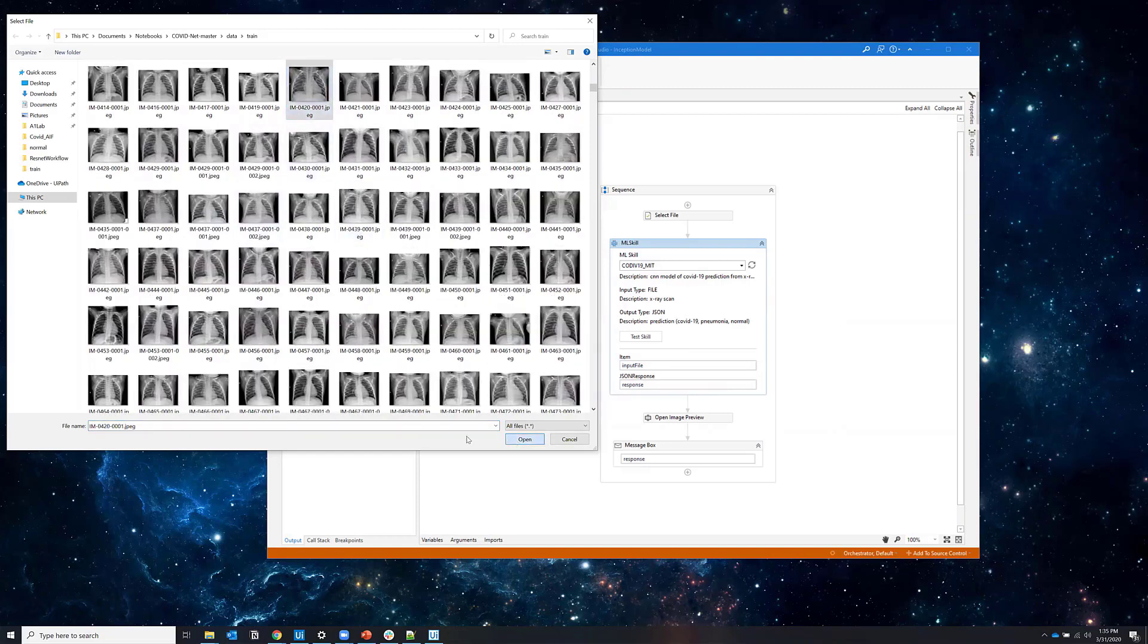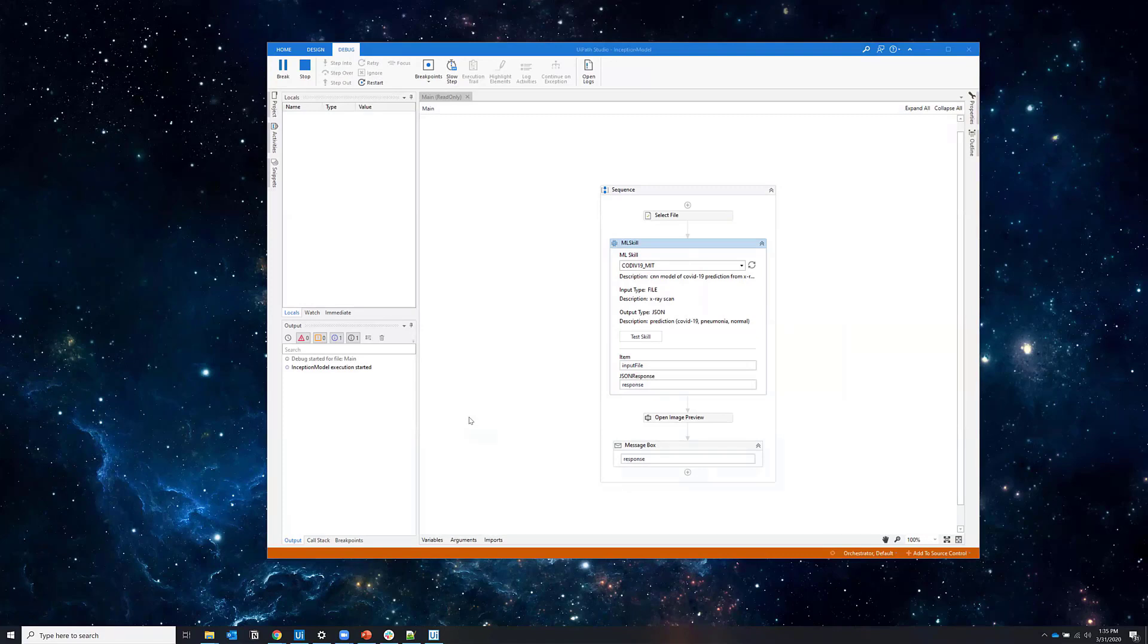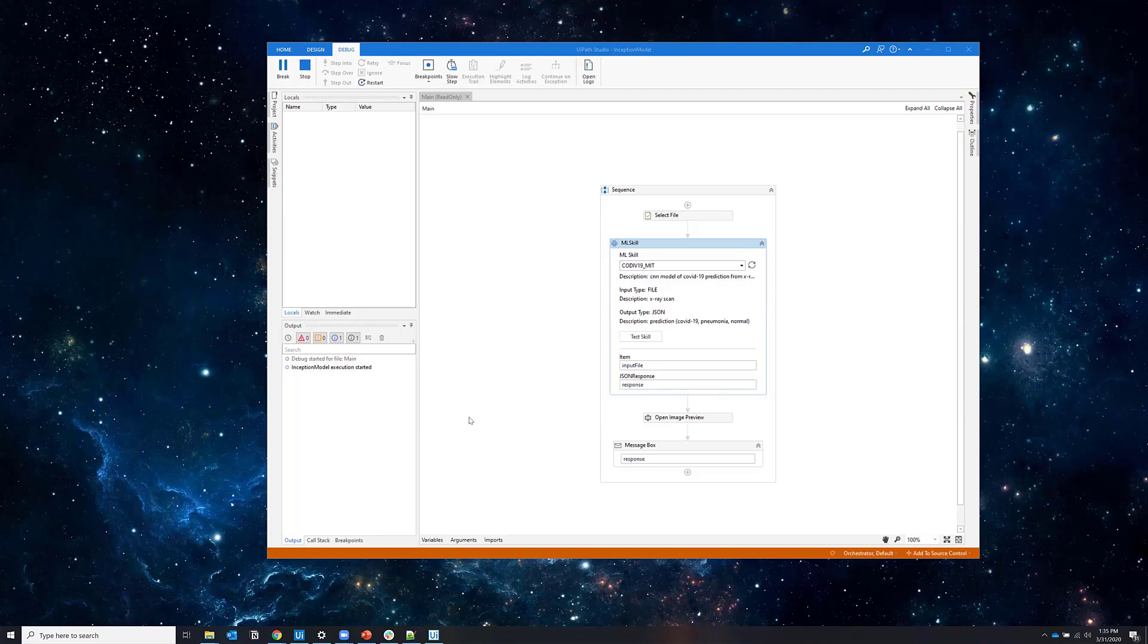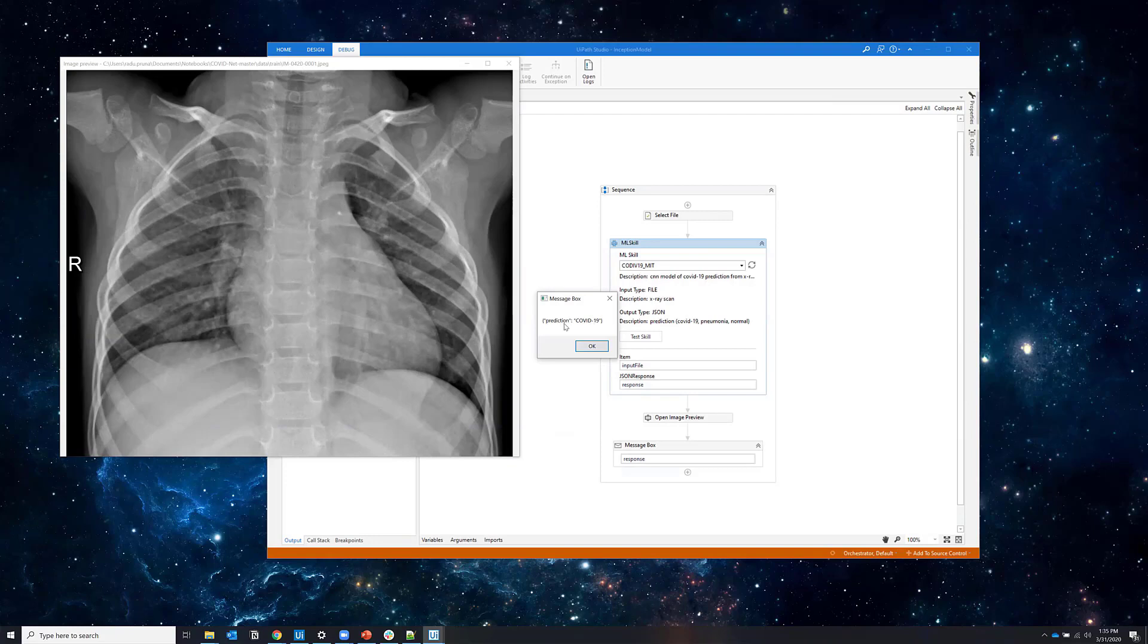So opening a random image, this is sent to the model. And what you'll see next is the machine learning classification result. So for this particular image, the prediction is that the image comes from a patient with COVID-19.